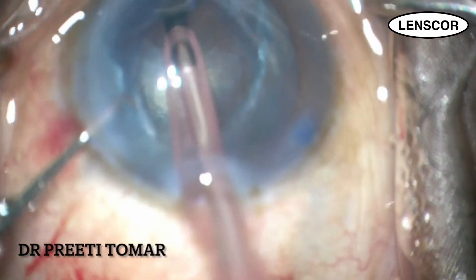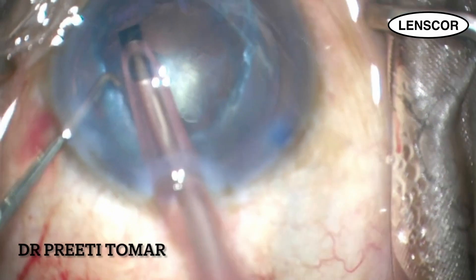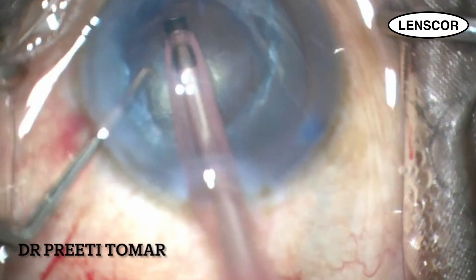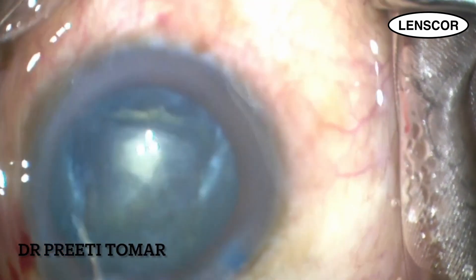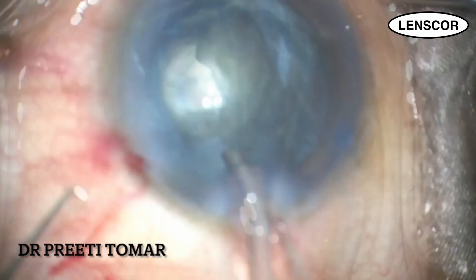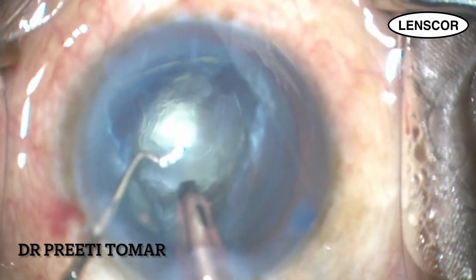The sub-incisional nuclear cortical sheet is difficult to aspirate, so I decide on viscodissection. But before coming out, I inject the OVD in this case to ensure that the anterior chamber does not collapse. I then dissect out the remaining nucleus and epinucleus sheet with gentle manipulation, and the loosened lens matter is then aspirated easily.